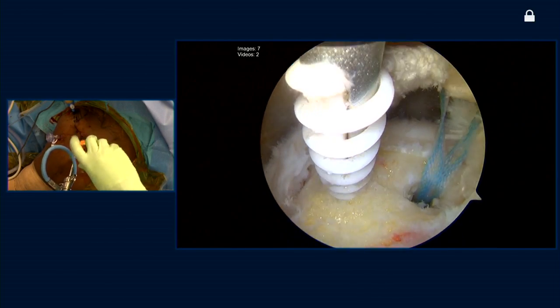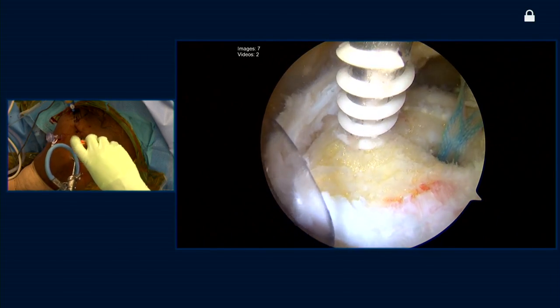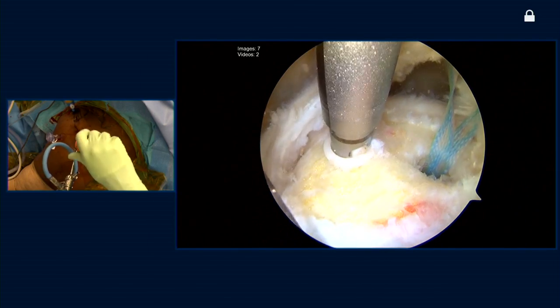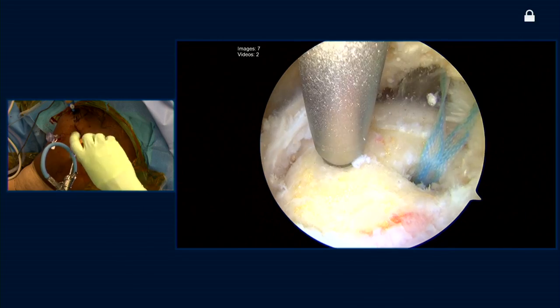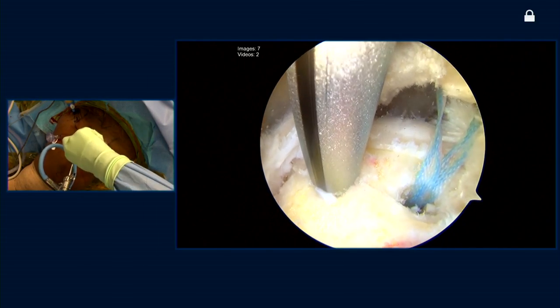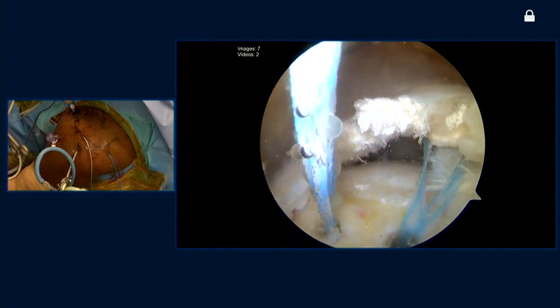Here you can see the second anchor — again, a helicoil anchor. You can appreciate the open architecture structure, which hopefully will help us a little bit with our biology. Amazingly, even though this structure looks fairly flimsy in comparison to traditional anchors, it actually has better pullout strength than most solid bore anchors.